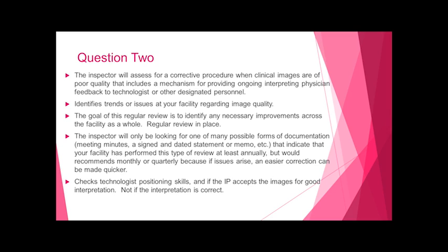So this checks the technologist's positioning skills and whether the interpreting physician accepts images for good interpretation, not whether the interpretation is correct. They're just making sure that, yes, this physician checked the images and they're of good positioning. So it's keeping the technologists on their toes, making sure that they are doing good positioning. This has to be done on every single technologist and every single doctor that interprets for your facility.